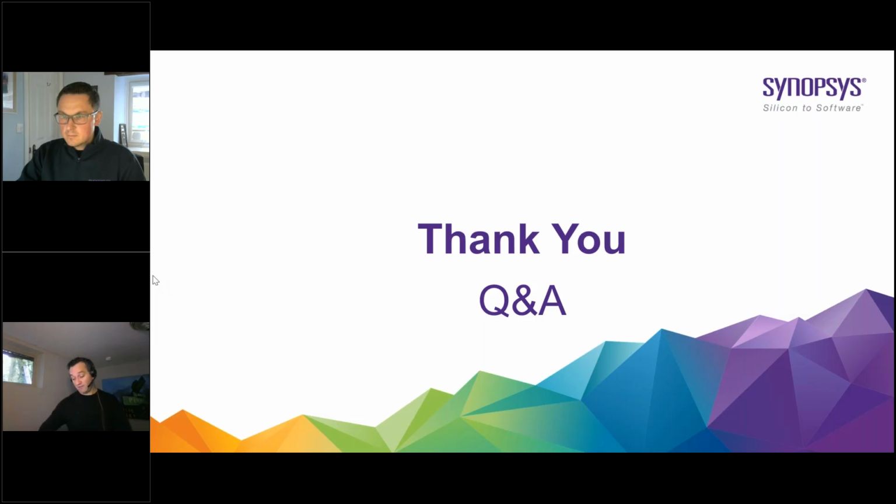So, we've developed tools for specific customers where they're getting a lot of revisions, a lot of noise, a lot of osteophytes, things like that. And if that data is correctly segmented and included in the ground truth and trained, it can be deployed correctly. And you can have, in some cases, a single click solution. But you're always going to have a human in the loop to review it. And the advantage that we have is we're built on top of Simpleware, which has been a 20-year process of building this segmentation tool. So if any kind of cleanup needs to be done, it can be done on an FDA cleared software. So that's how we deal with errors.